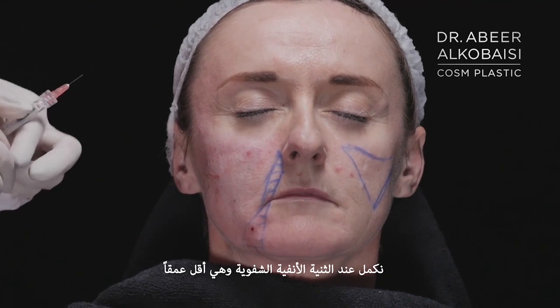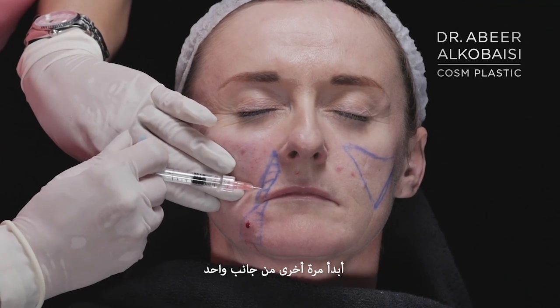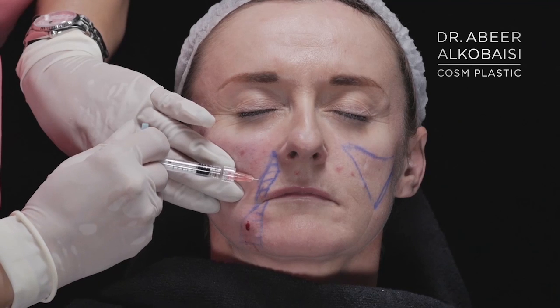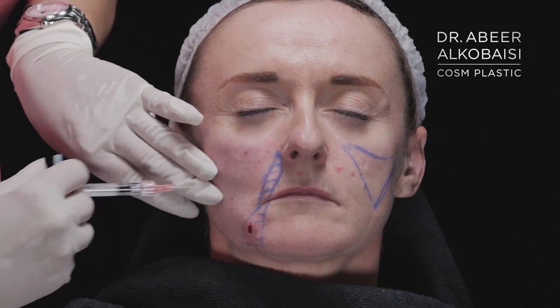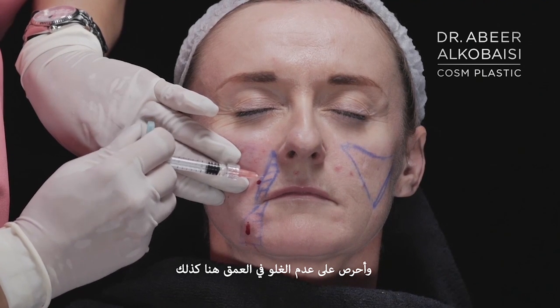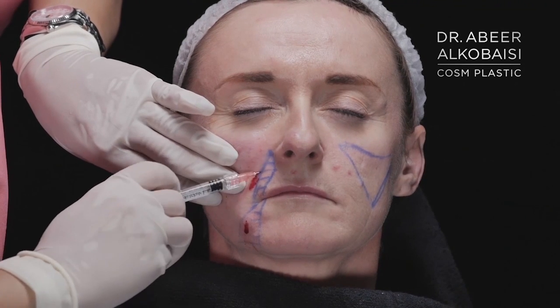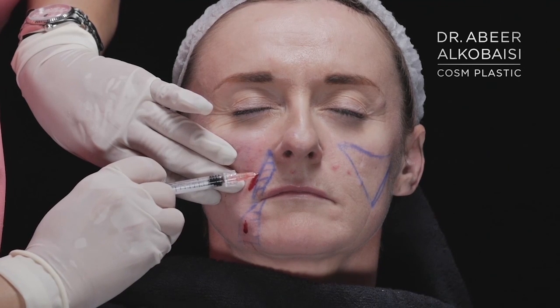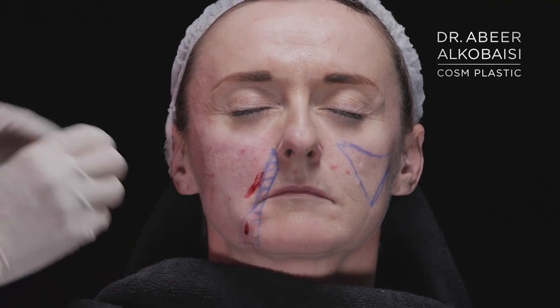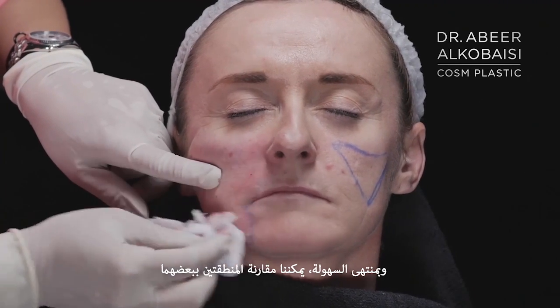We continue with the nasolabial fold, which is less deep. And again, I go from one side. And again, I try not to go very deep here. And very simple. Now we can compare the two areas.